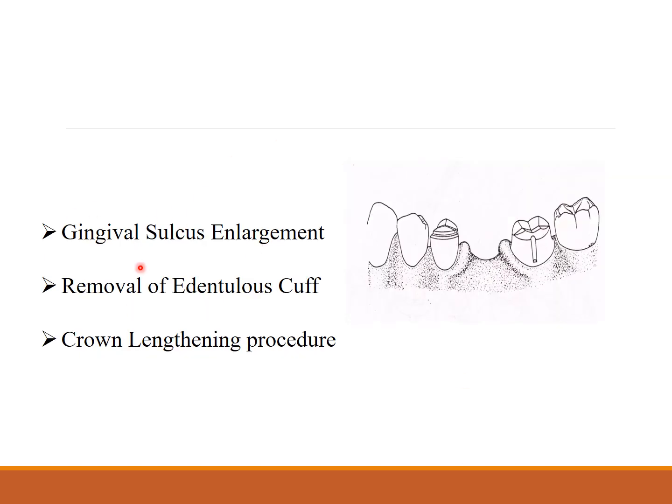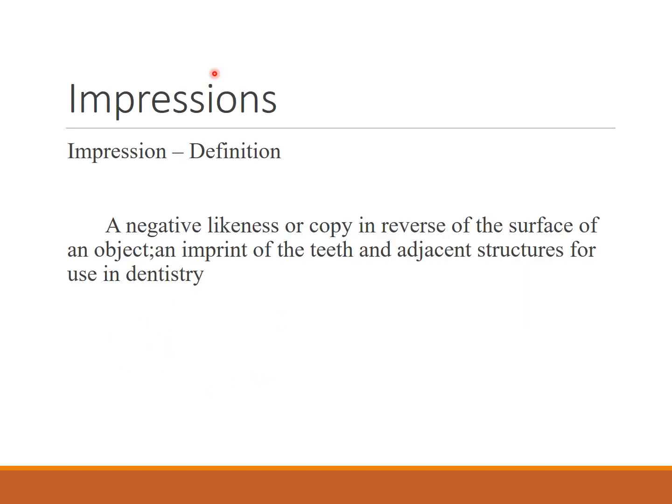It can also be used for gingival sulcus enlargement, removal of edentulous cuff, or crown lengthening procedures. In these indications it can be used. So that was the end of gingival retraction, the types and the techniques used.